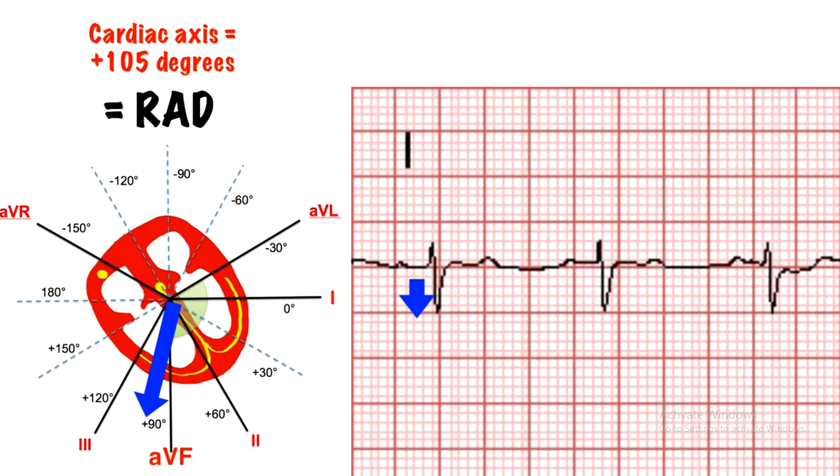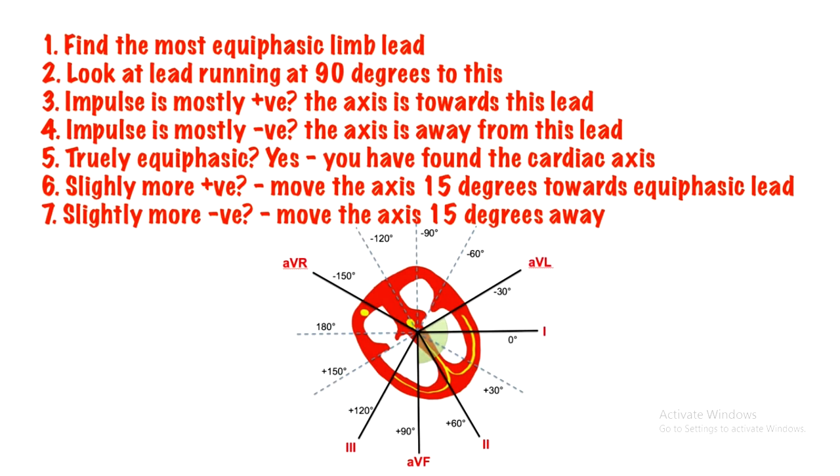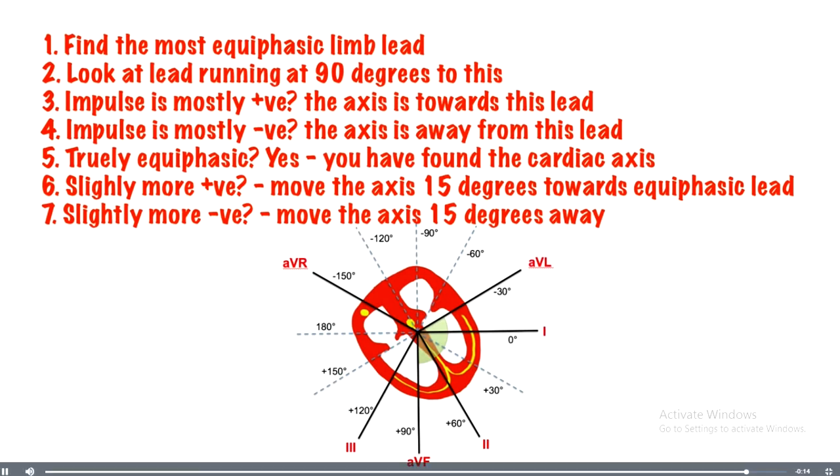There you go, the basics of the cardiac axis in under 5 minutes. Use this information to dig deeper into the cardiac axis and go and see as many ECGs as you can, and make sure you work out the axis on them.